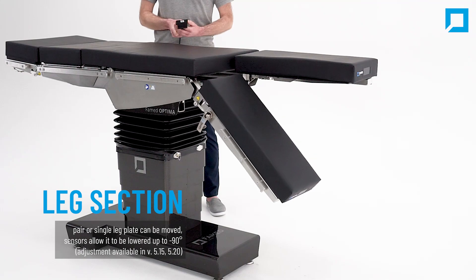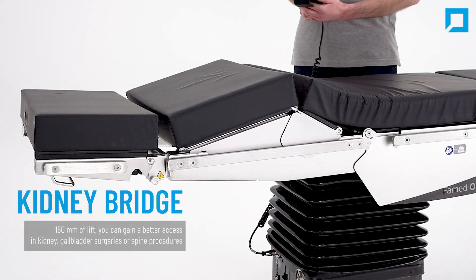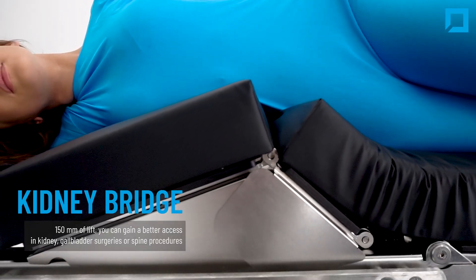Sensors allow the leg section to be lowered up to negative 90 degrees. The kidney bridge offers 150 millimeters of lift, giving you better access in kidney, gallbladder, or spine procedures.